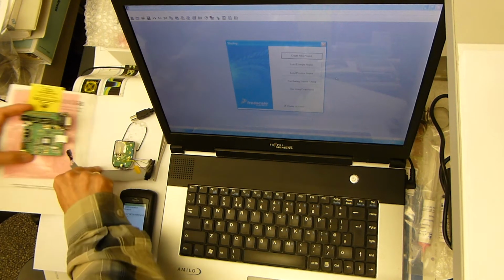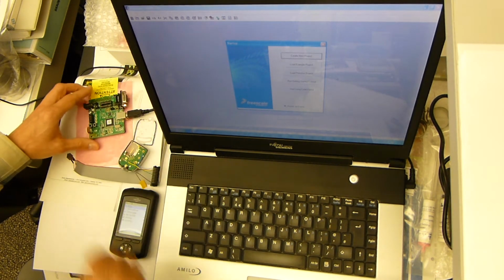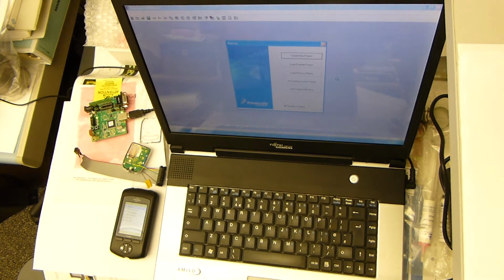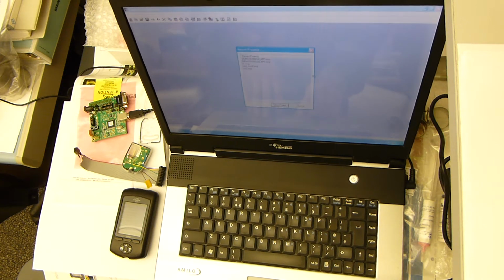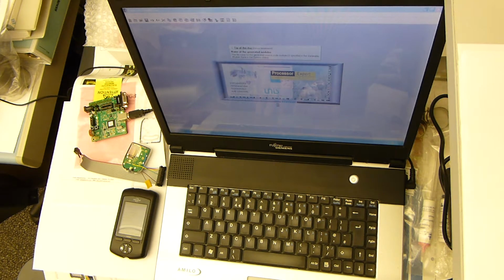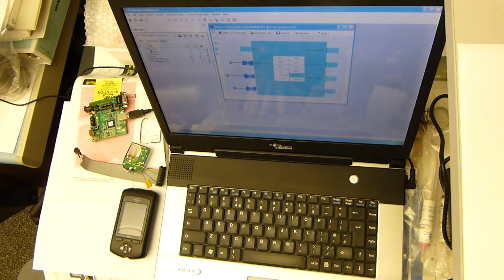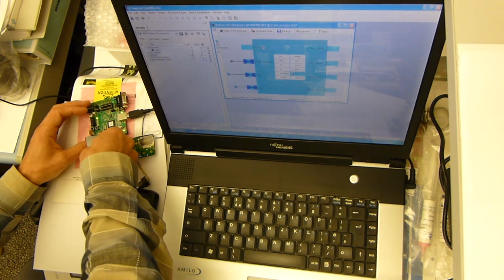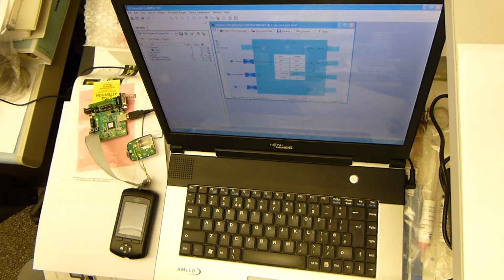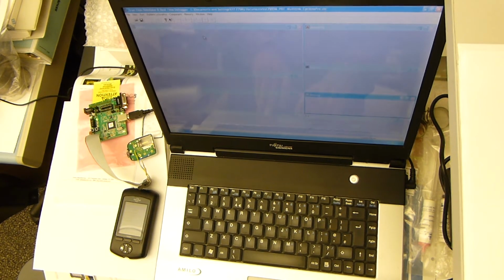So we plug this board into USB, and we use the Freescale CodeWarrior software that came with this board to program the flash inside the pod. We load a test project. It doesn't matter what project you use because we are only interested in the flash programming part. So we plug the pod into the board and we go into debug mode.